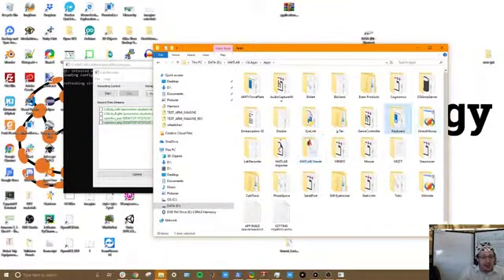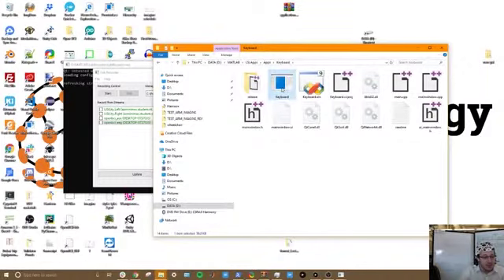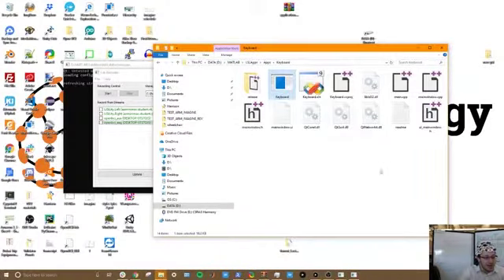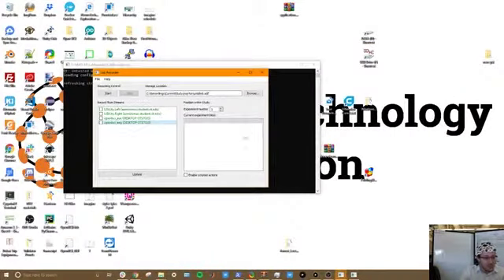And another thing is this wonderful tool called the keyboard application. And it looks really silly and really simple. There's just a link button. There's not even a minimize button. But actually, I can click this little corner button here and it'll minimize away. So now what that did was it just linked my keyboard to LSL. And there it is. So now I can actually record keyboard events.